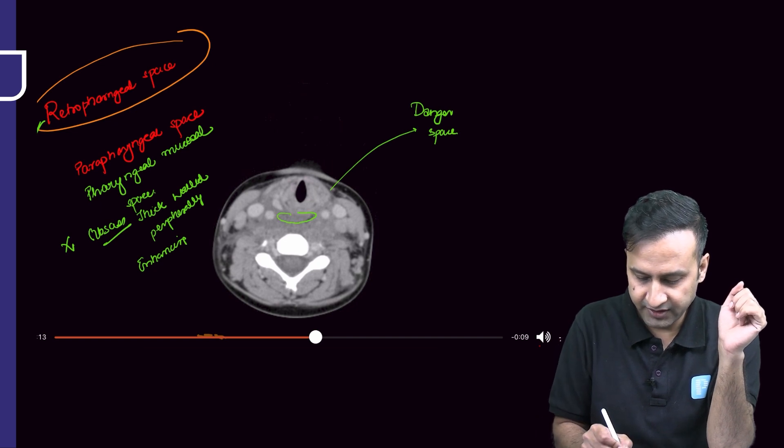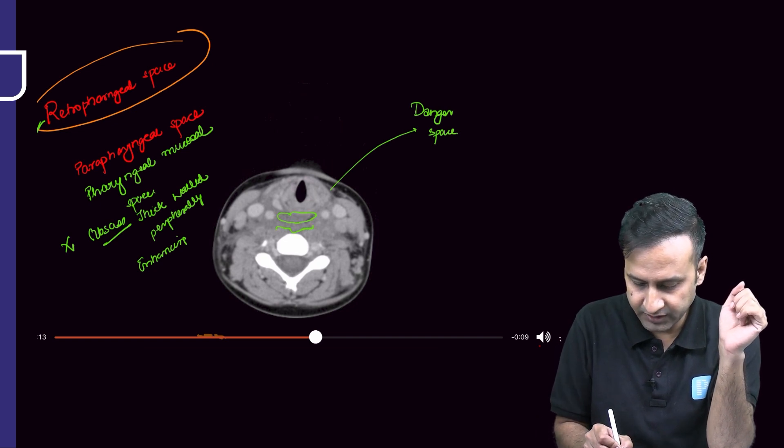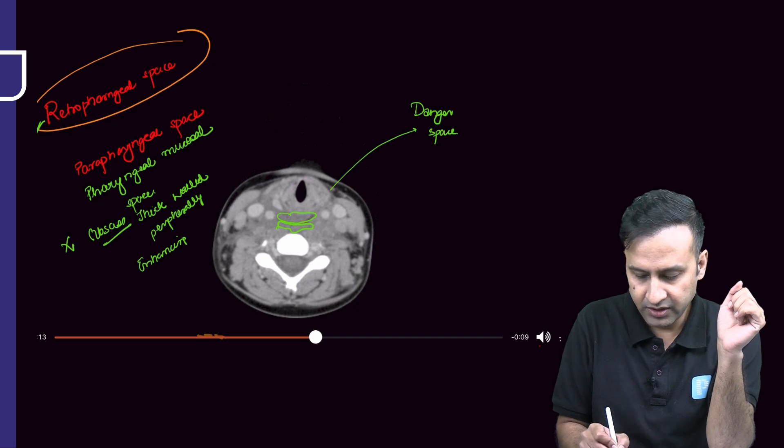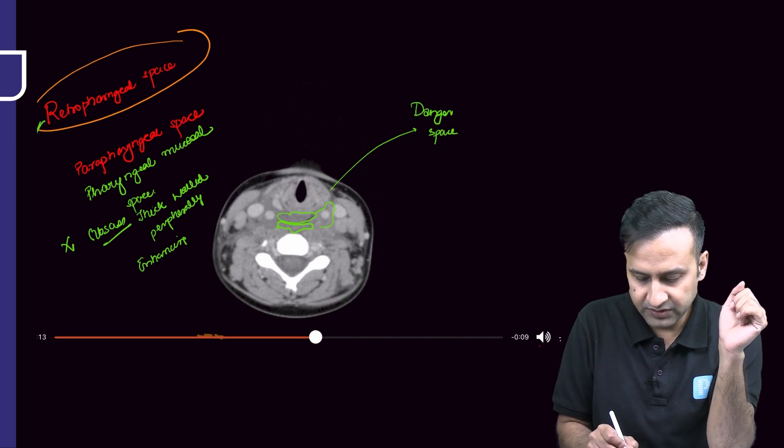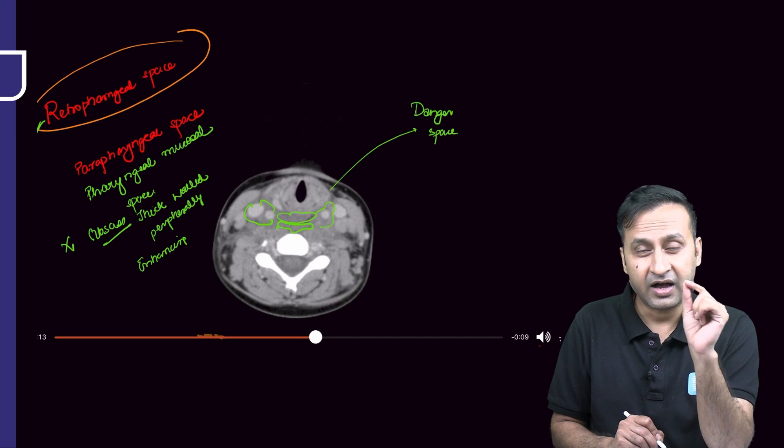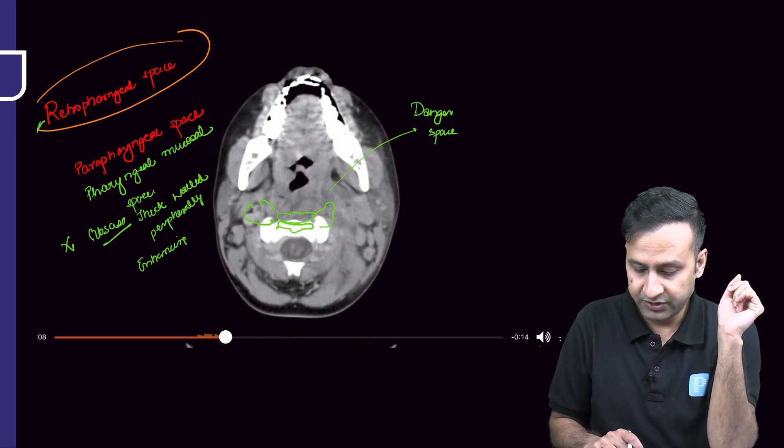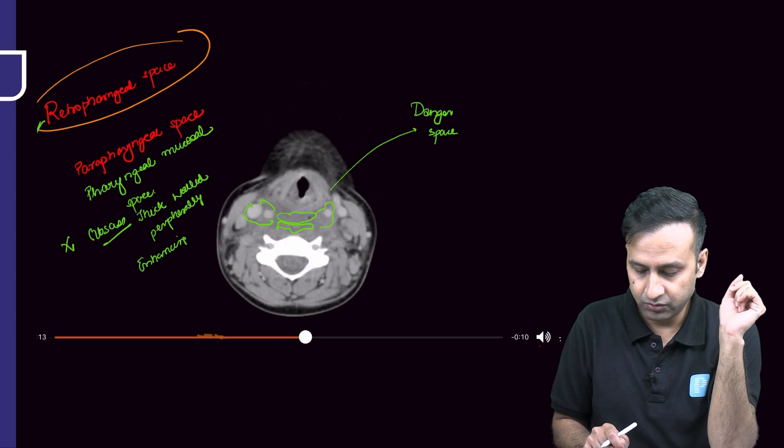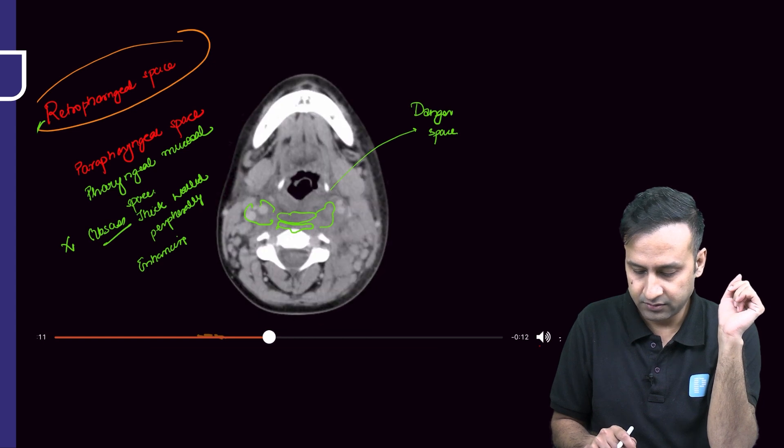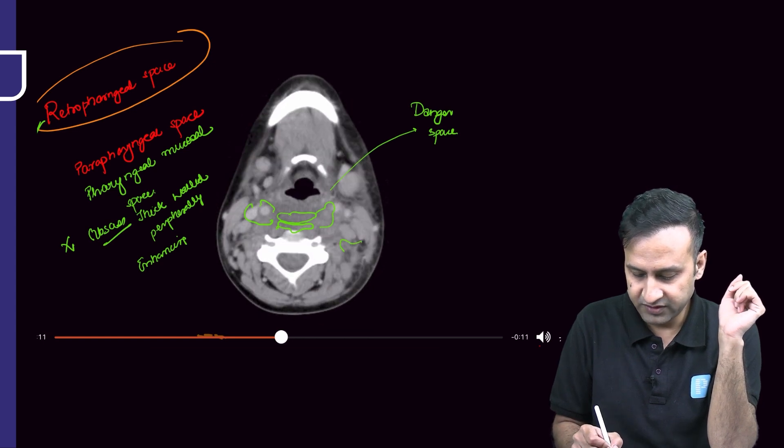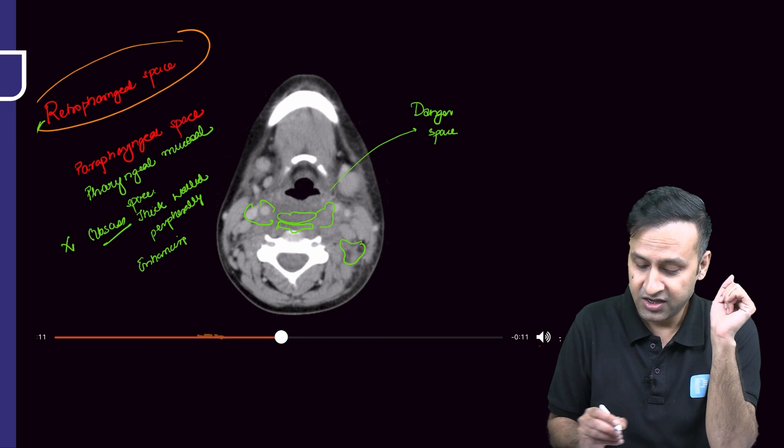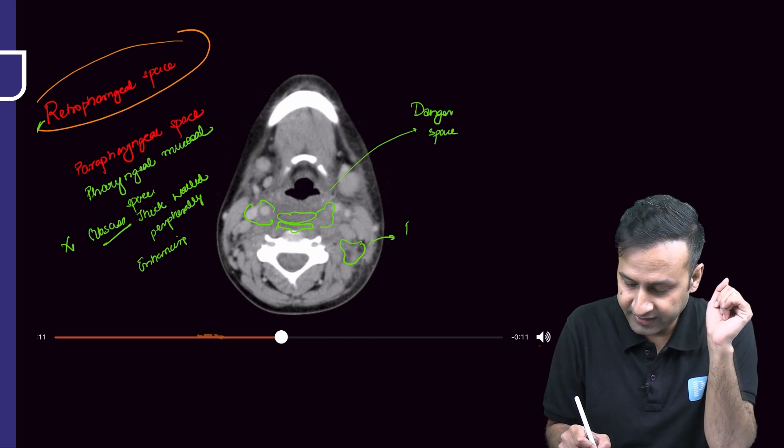When I'm going inferiorly, specifically at this level, obviously this is the retropharyngeal area, but I can see some soft tissue edema posterior to the retropharyngeal area also. In fact, I can see some soft tissue encasing the carotid space also, so it means there is a high likelihood of danger space involvement. What is this particular space? This is the other important infrahyoid neck space: the posterior cervical space.